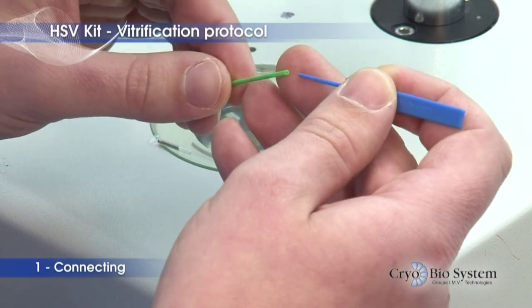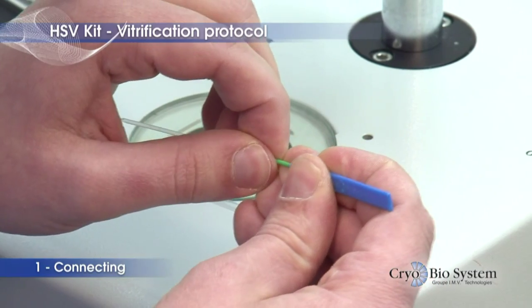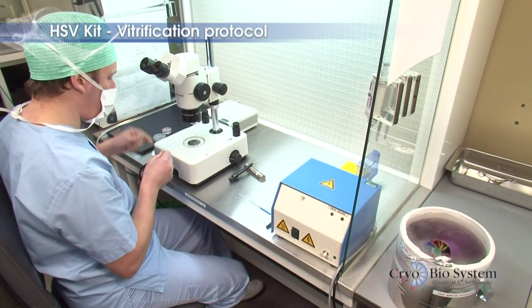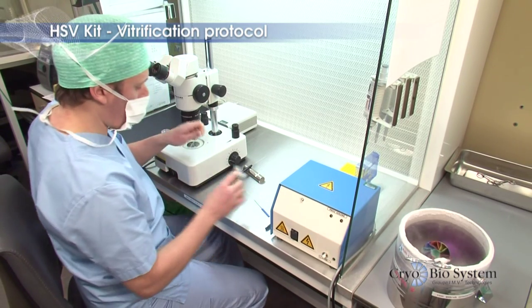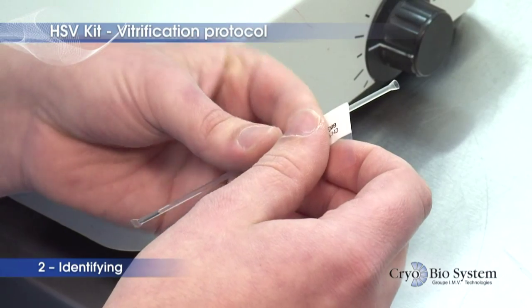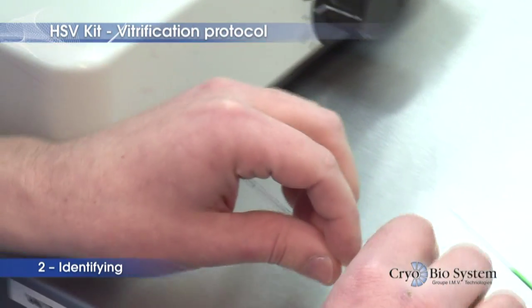Connect the blue insertion device to the coloured handling rod. Prepare the straw identification, making sure to use a cryogenic LN2 resistant label marked with permanent LN2 resistant ink. Apply the label at least 20 mm from the flared extremity of the straw.